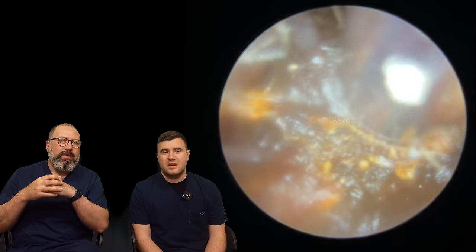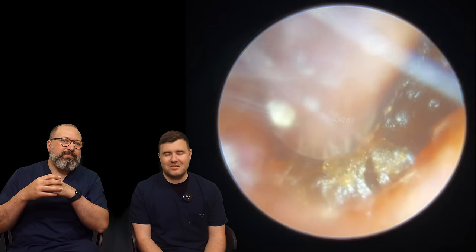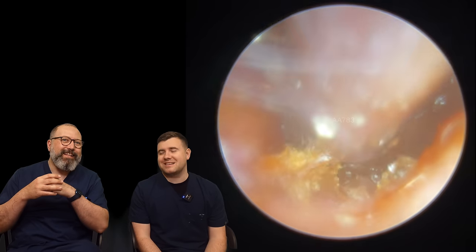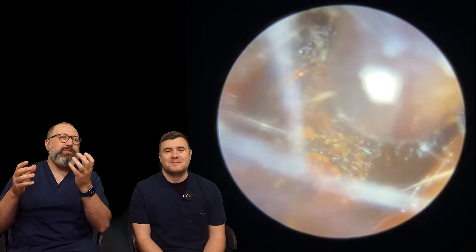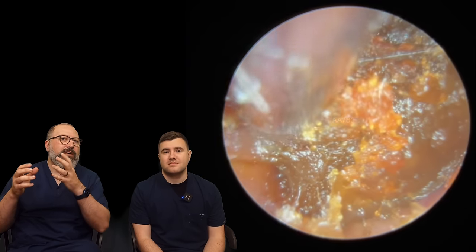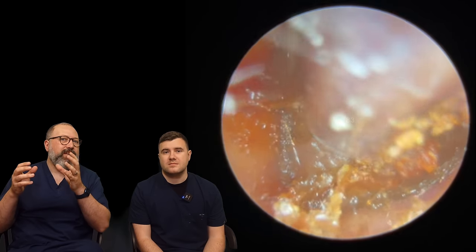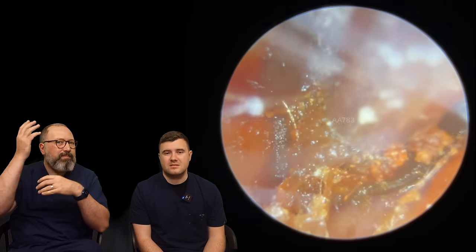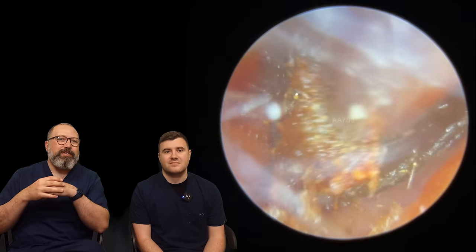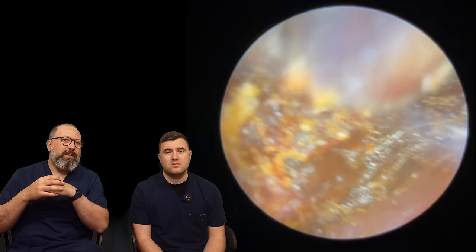Yeah, I find the same thing — you always know as soon as you see this kind of super sticky wax, you just know how long is this gonna take. Sometimes you can pop a little bit of olive oil in there and that's gonna get everything moving, but sometimes the olive oil is more of a hindrance than a help because when you actually pop the olive oil in it just coats all the little cilia on the outside part of the ear and then it starts to blur the camera, so you've got to be kind of selective with the ones you put the olive oil in. It's starting to move now though.